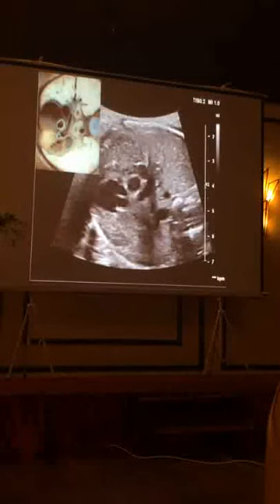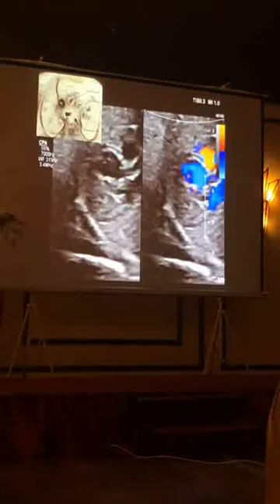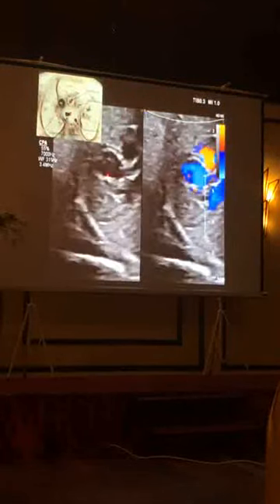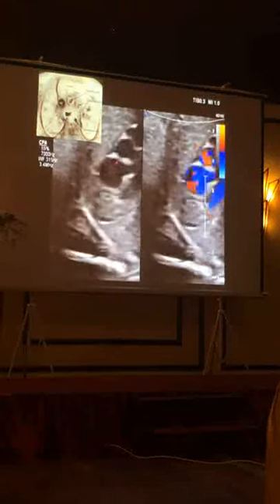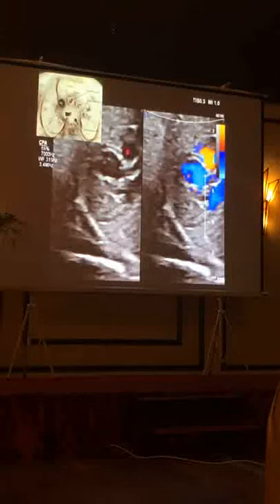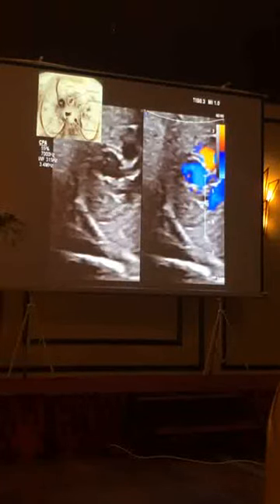And this is, again, depending on the position of your transducer, because if you tilt it more like an oblique plane and cut three vessels in this way, as presented here, you see three circles, and there's a pulmonary trunk, aorta, and superior vena cava, and again it's normal. It just depends on what you are doing.